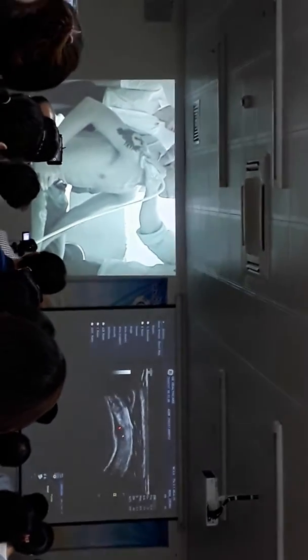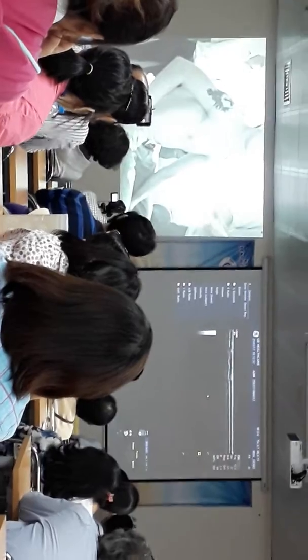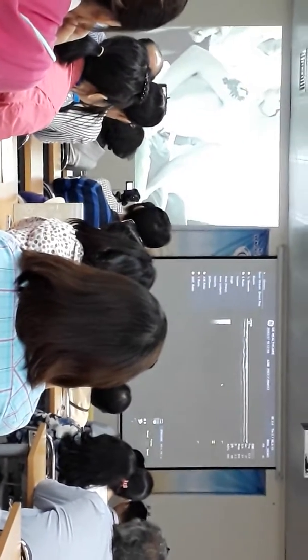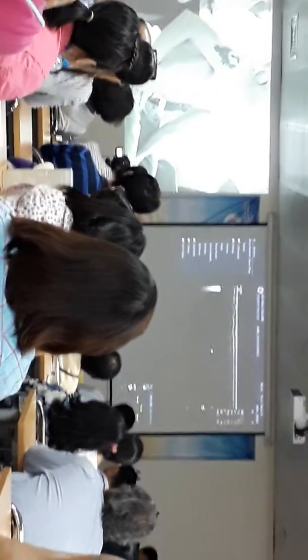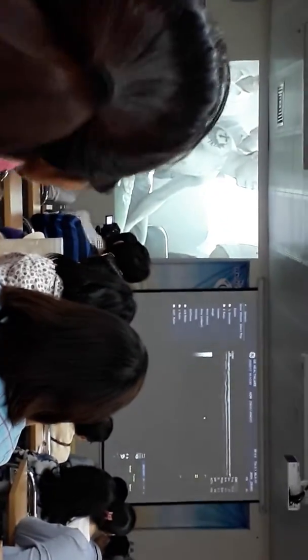And we should not mistake this for tendinitis, because it is only the change in direction of the tendon as it attaches to this structure. So next I have a look at the infraspinatus tendon. I just get the patient to pop their hand onto their opposite shoulder.